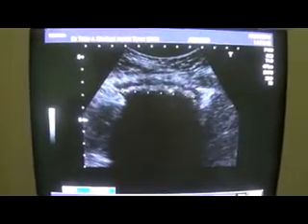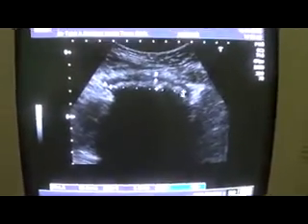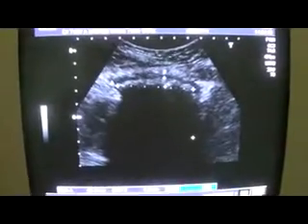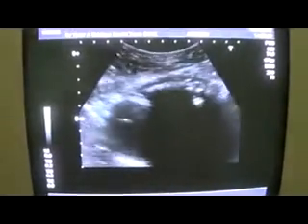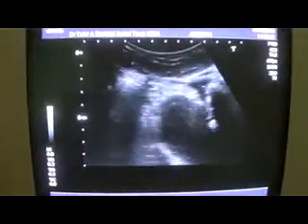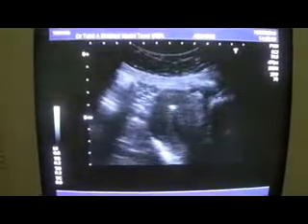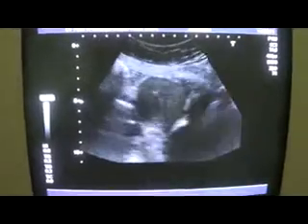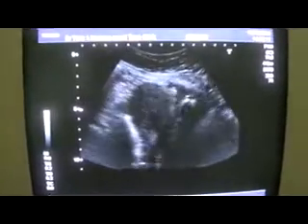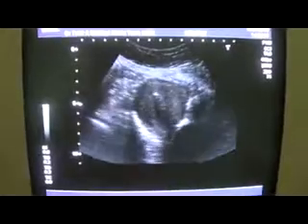of echogenic linear structure measuring here 5.6 by 6.5 millimeters. And the important thing is the degree of posterior shadowing from it, which is indeed suggestive of a foreign body. And here I am at the umbilical region, and now here you will be able to see the fundal region and the endometrial canal.